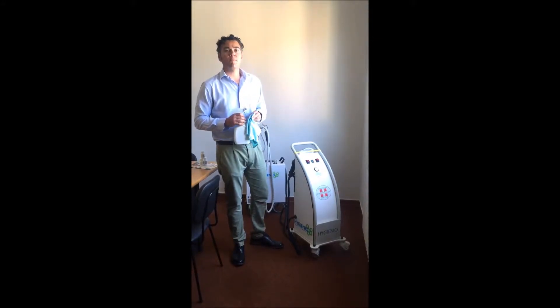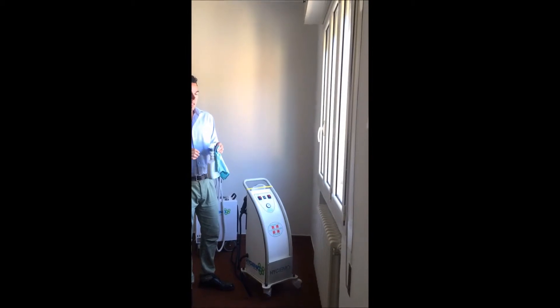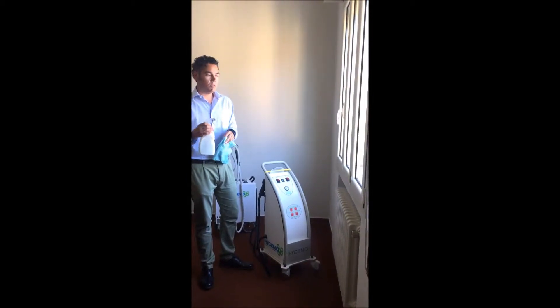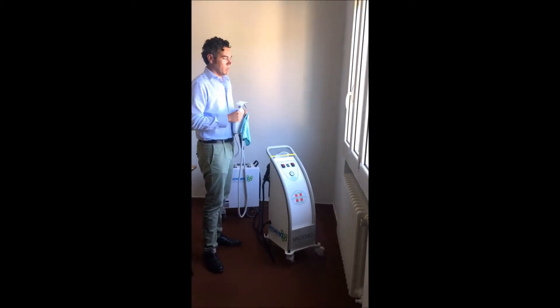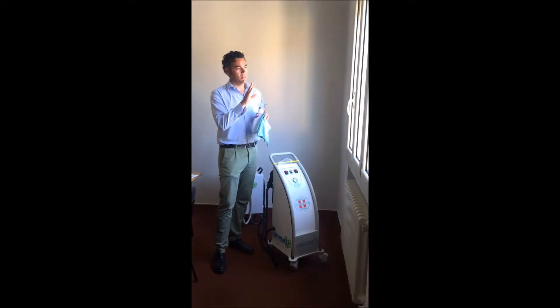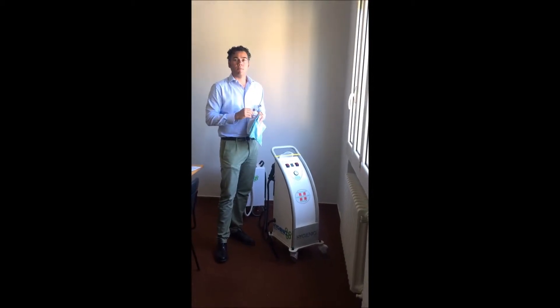I will show you. I have in front of me a window divided into three different parts. On the right side I will use the traditional way — I will use the spray. In the middle one, I will apply with Arginium a disinfectant solution. And on the left side I will use only steam.